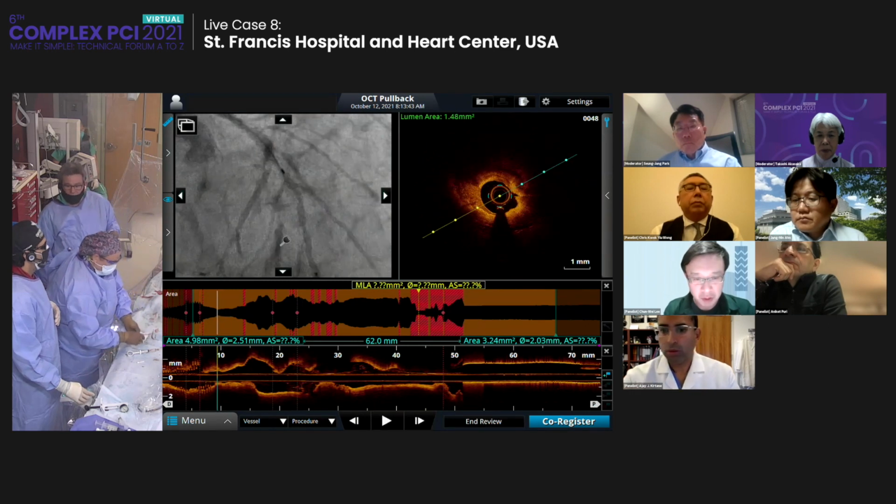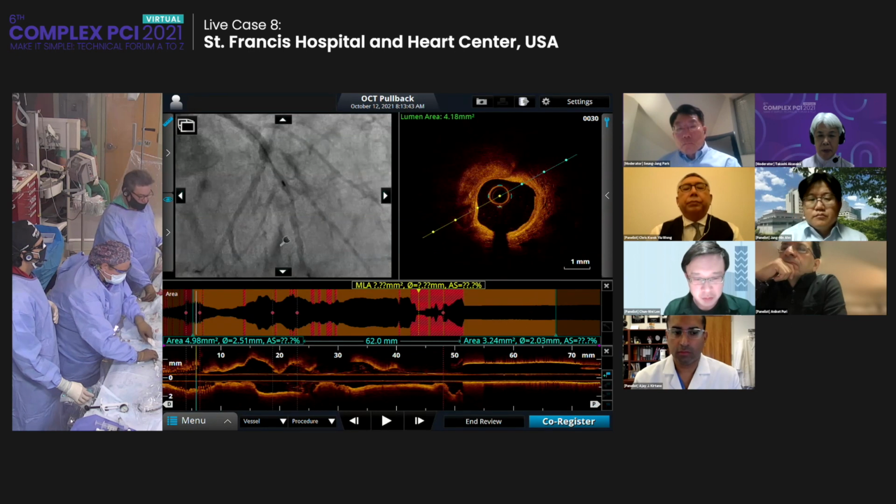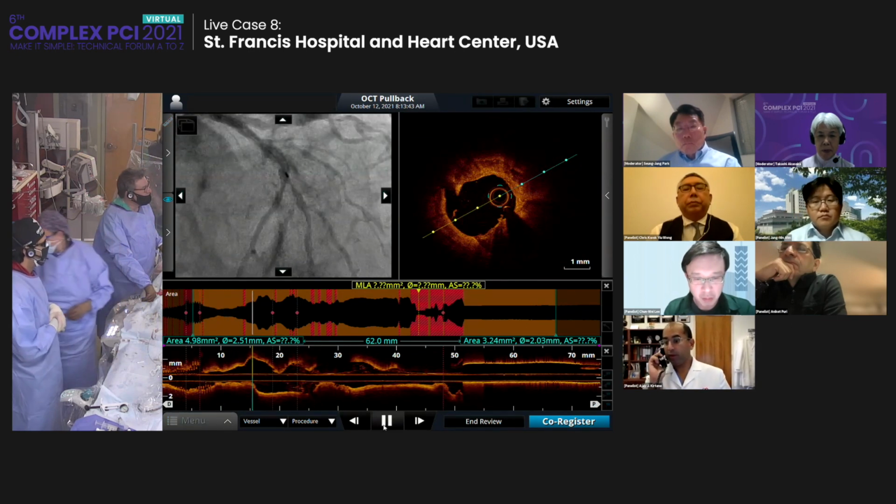I don't think I went that far. I agree. Yeah, I think we go back down with our 20. We'll go back with our 20, but let's just scroll through for you in the meantime. Can we have that Shockwave back, please?